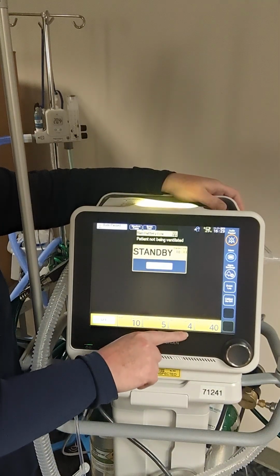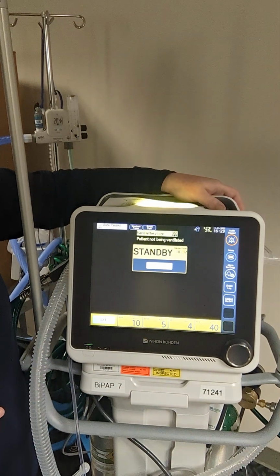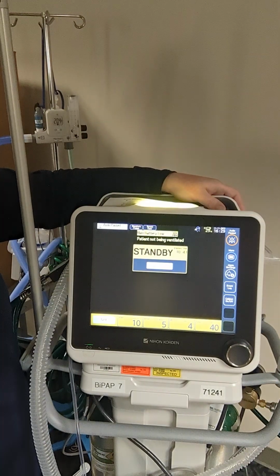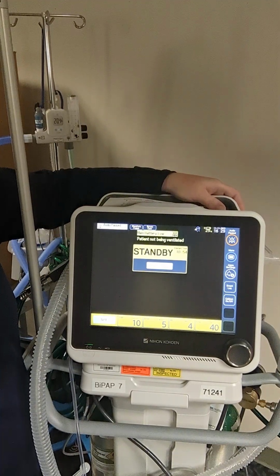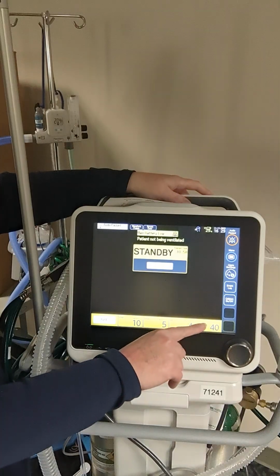We also have a backup respiratory rate. That is merely there to keep us informed if the patient were to become apneic for a prolonged period of time, meaning their respirations are low and they're not initiating any breaths. We are going to look to that if it alarms, because that lets us know that perhaps their respiratory state has changed. The last value we see here is FiO2.